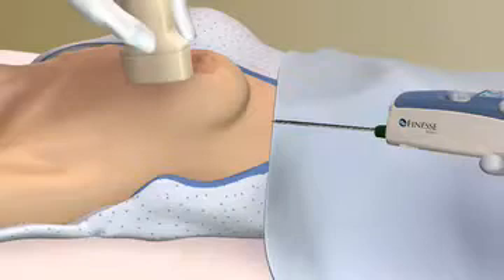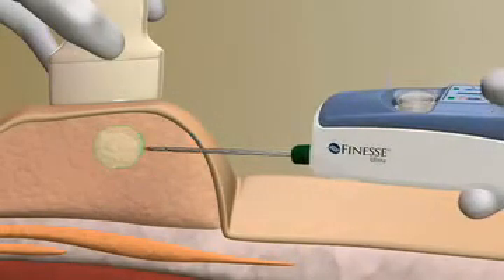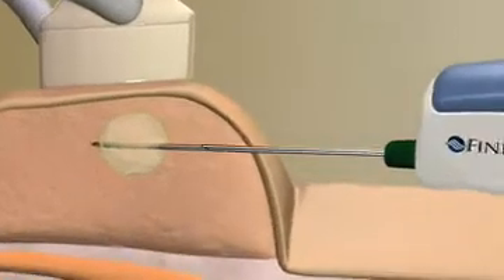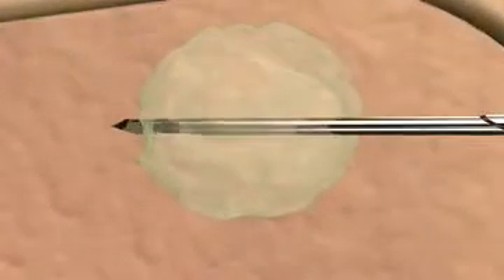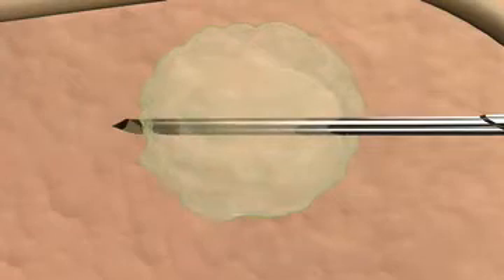Let's take a look at a procedure using ultrasound guidance. Locate the lesion and insert the probe into the breast. If the tissue or lesion is very dense, you can use the optional piercing mode to easily penetrate the tissue for accurate probe placement without displacing the lesion. Press the sample button to acquire a tissue sample; with each press of the button, another sample is acquired.